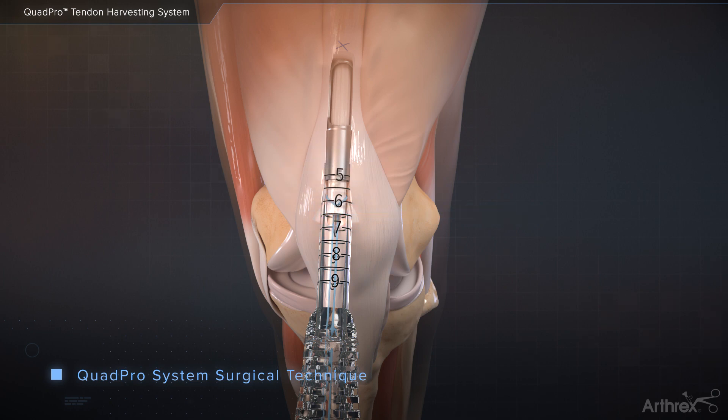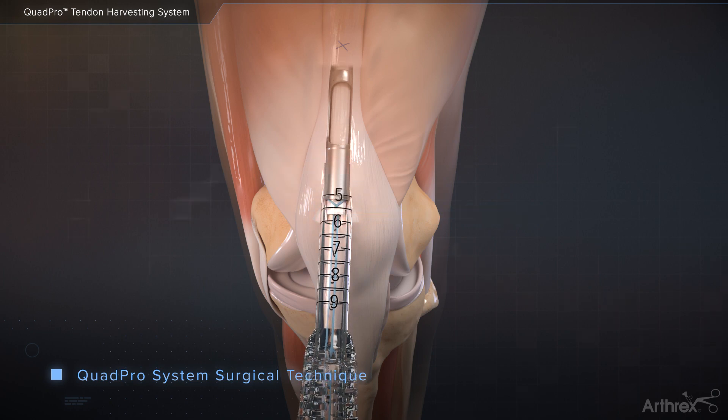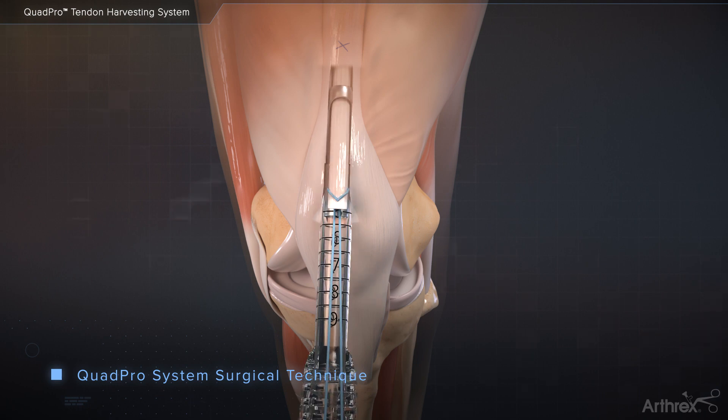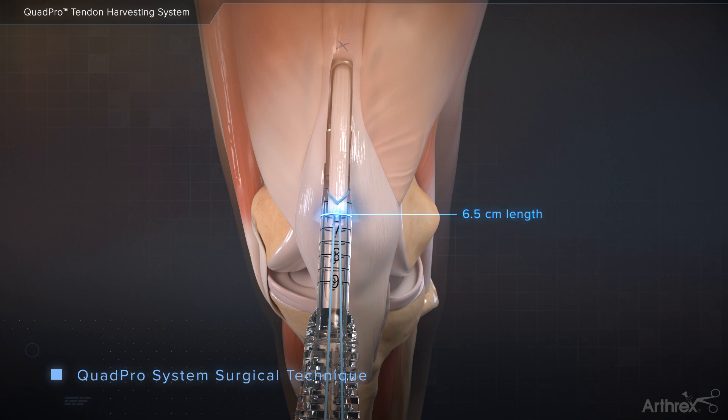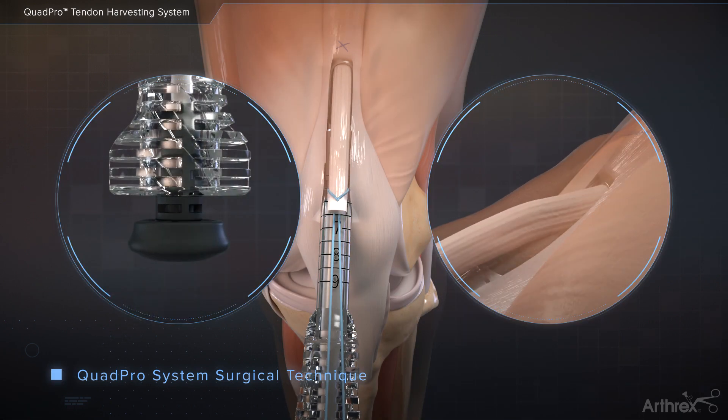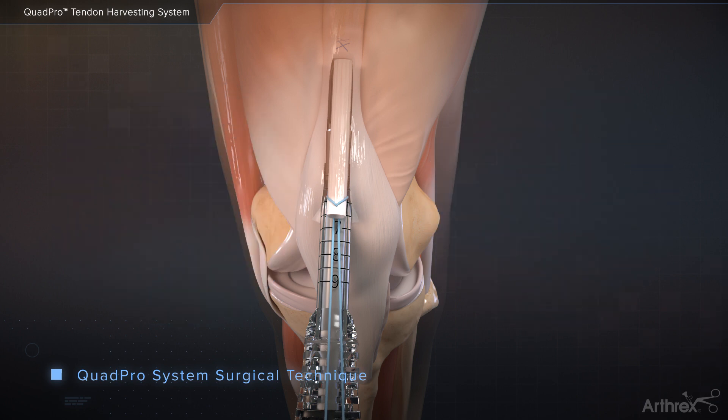Once the desired graft length has been stripped, the QuadPro Tendon Harvester can be withdrawn from the incision and the graft can be retrieved through the graft cutting window by grasping the tagging sutures. Advance the QuadPro Tendon Harvester back into the incision. When the appropriate graft length is reached, insert the pushrod into the harvester. Keep tension on the tagging suture and advance the pushrod forward to amputate the graft.